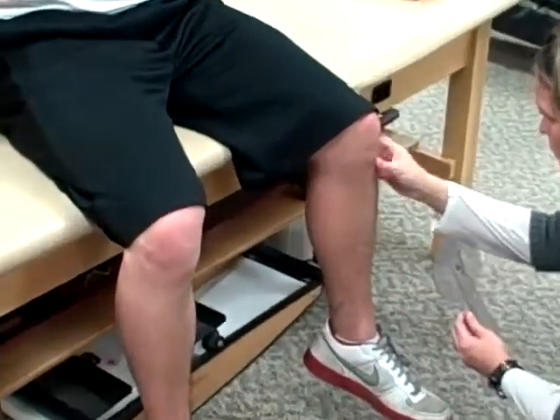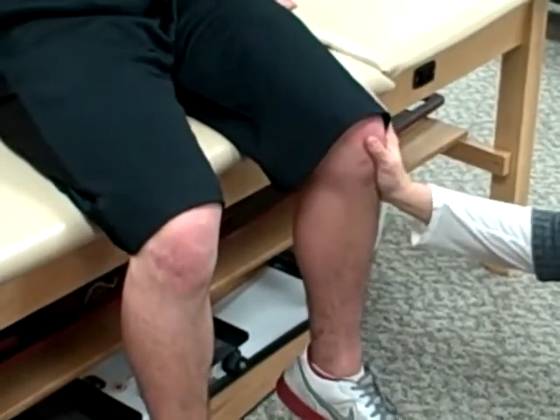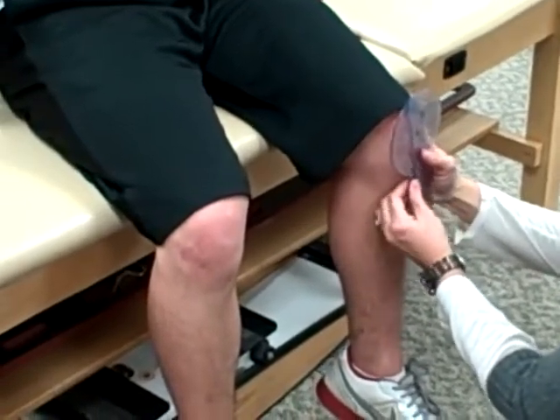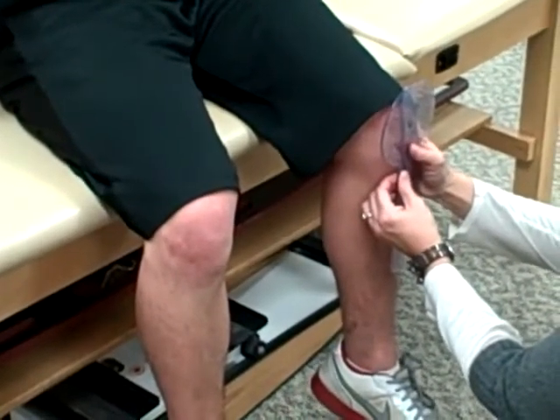Alright, to measure medial and lateral rotation of the femur, have them in a seated position, a short sit position. Your axis of rotation is at the mid patella. Your stationary arm is going to be perpendicular to the floor. Your movable arm is along the long axis of the tibia.